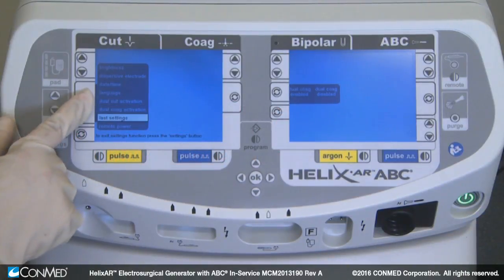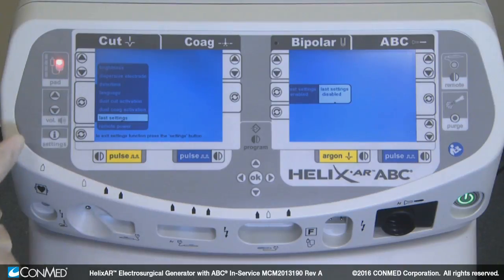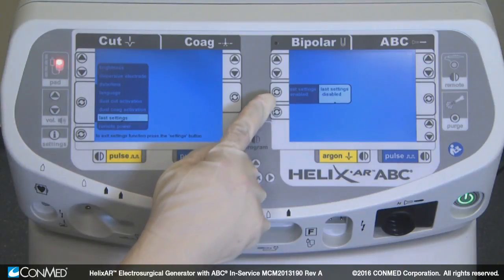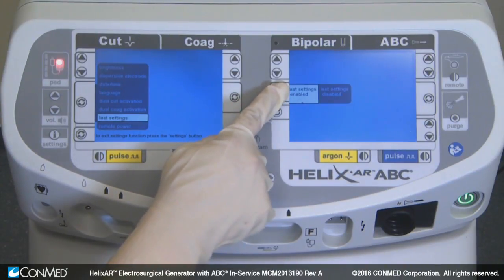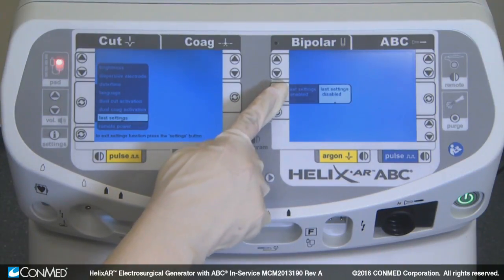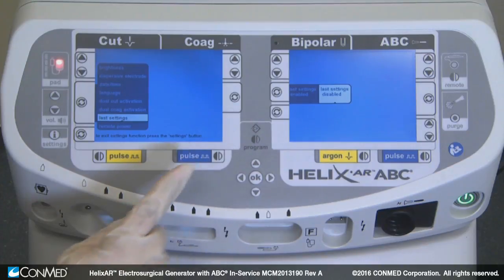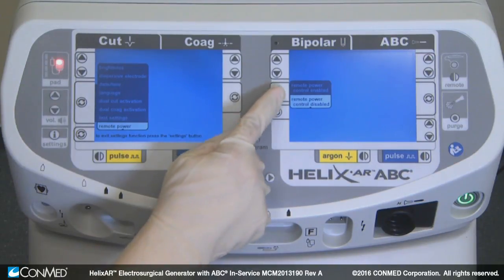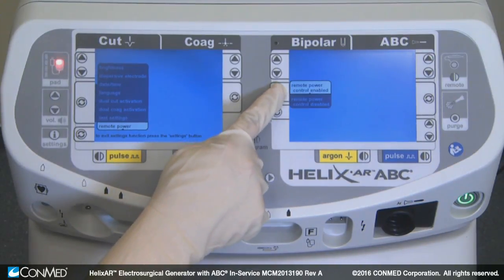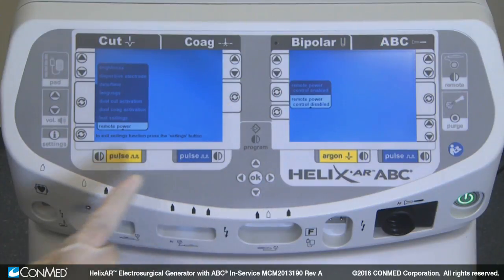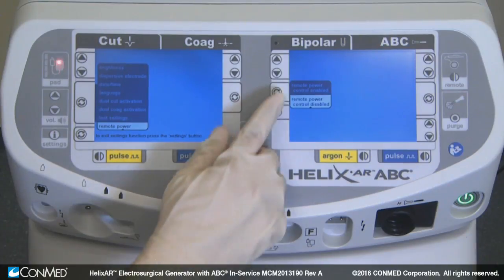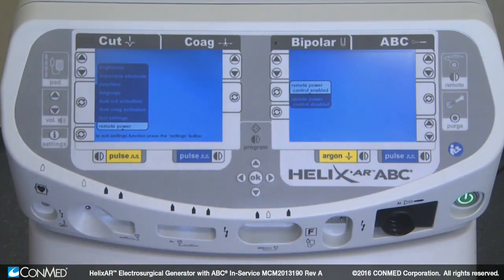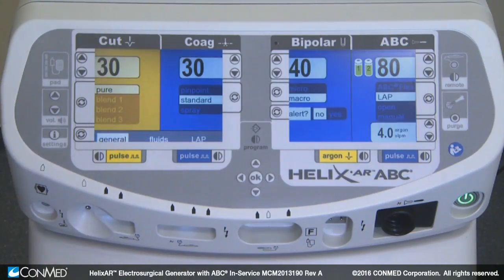Last settings allows the unit to use the last settings that were selected when the machine was last powered off, or this can default to 0. Remote power enables or disables the remote power feature. Once enabled, exit out of the settings menu and press the remote control key to activate.